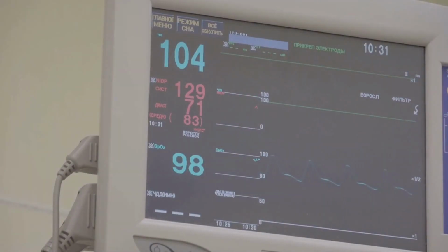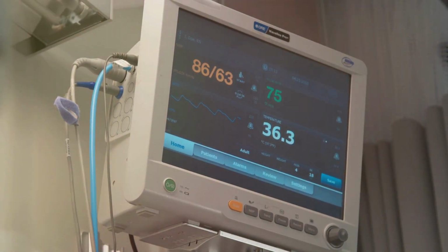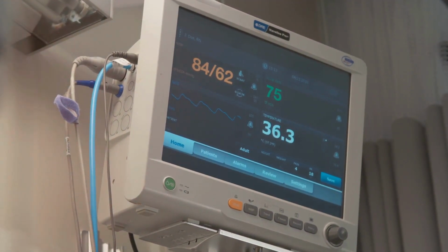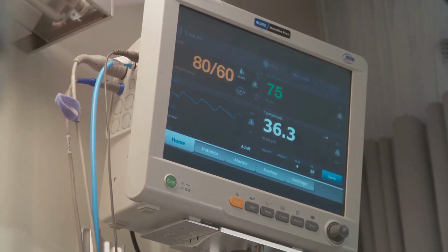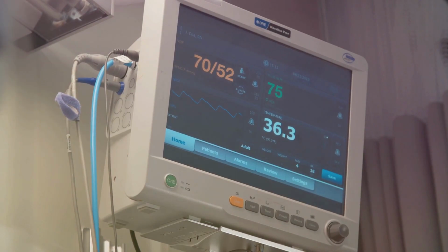Next, we have the respiratory rate. This is the number of breaths the ventilator gives per minute. For adults, this typically ranges between 12 to 20 breaths, but may be adjusted based on the patient's condition. It's the rhythm of the breath, the metronome that keeps time for the symphony of ventilation.